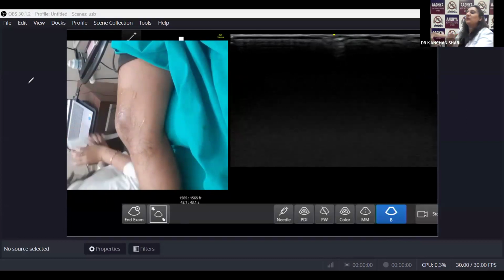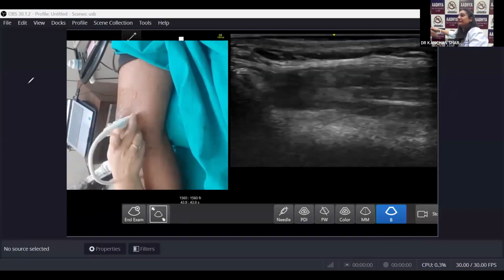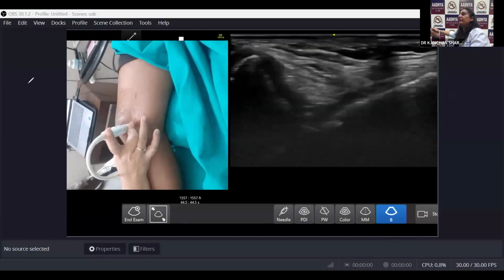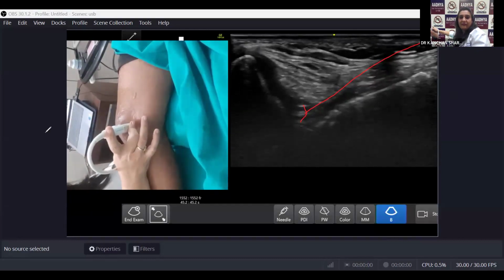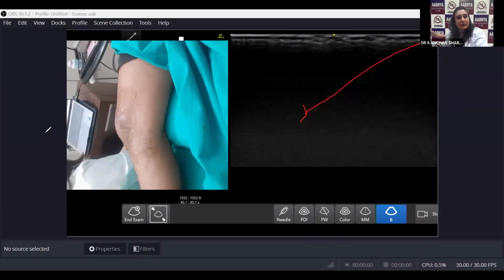And I will show you one more thing. Thank you for reminding me; that is very much important, which I had forgotten. So you can come from this side also. You can inject here. But I have done only 2 or 3. I used to do it before, but now I have stopped it because there are so many ways to identify the suprapatellar recess even though you don't have a fluid.